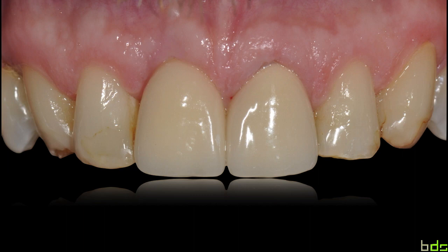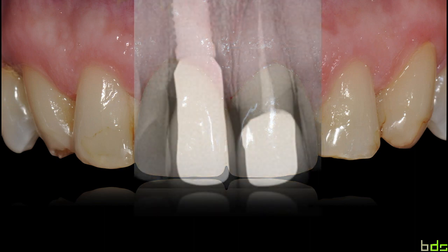Here in that case, for example, it's hard to tell which one is an implant and which one is a tooth. Now, with the revealing X-ray, we know that the right central incisor is the implant. Now, the question I ask myself is, why did I get this good result? Is it because of the macrogeometry of the implant? Here in this case, we used a 3i implant, which has a polished collar, internal connection. Is it because, had I used another implant, would I get the same result? Or is it because I used this implant that I got this result?